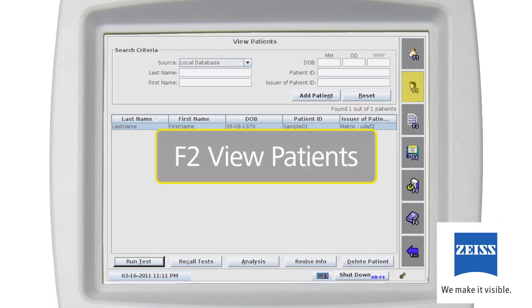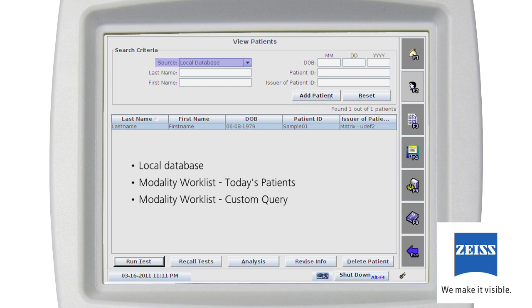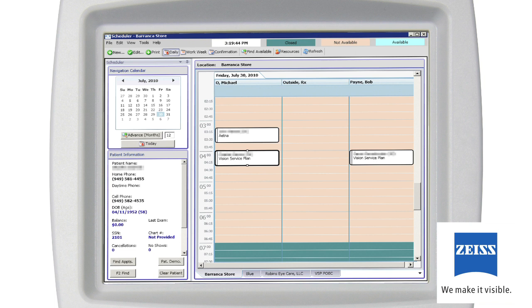Either selection proceeds to the View Patients screen, F2. On the View Patients screen, you can select an existing patient from the following sources on the Source drop-down menu: Local Database, Modality Worklist Today's Patients, Modality Worklist Custom Query, or OM Local. Choosing Local Database allows you to access patient data located directly on the Humphrey Matrix database. Modality Worklist Today's Patients quickly displays all patients' exams scheduled for today. Modality Worklist Custom Query allows you to query for scheduled patients. These features are available only if you have DICOM Gateway enabled.